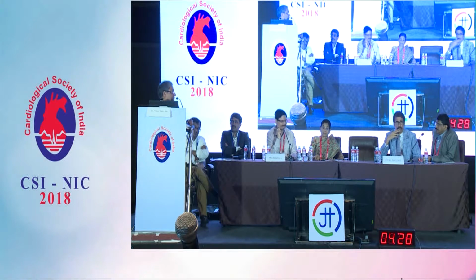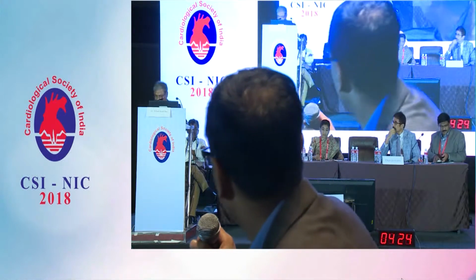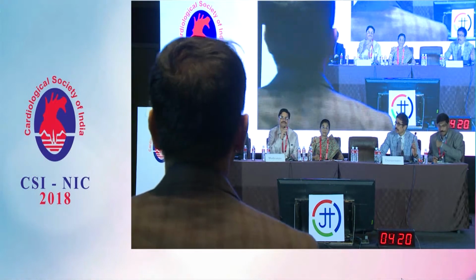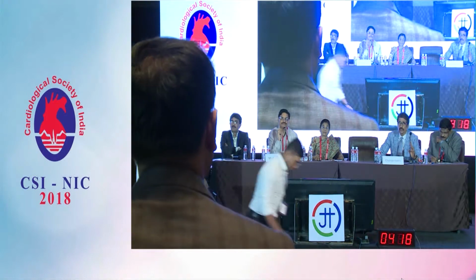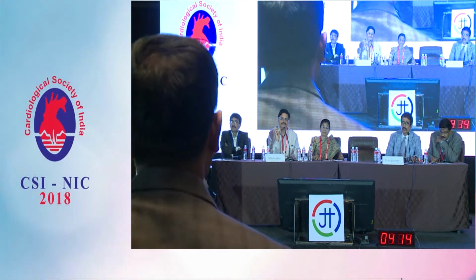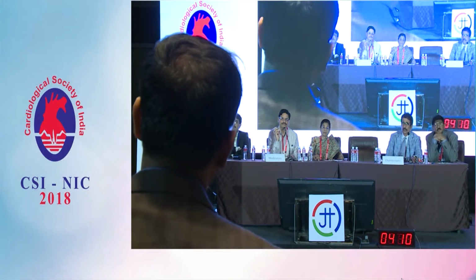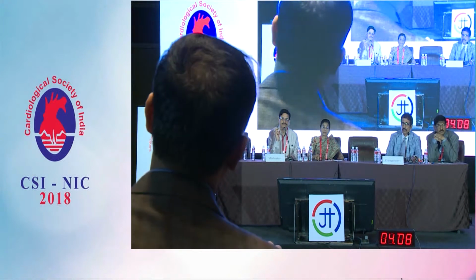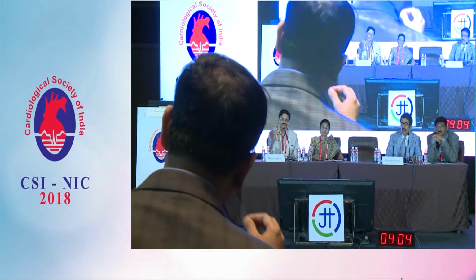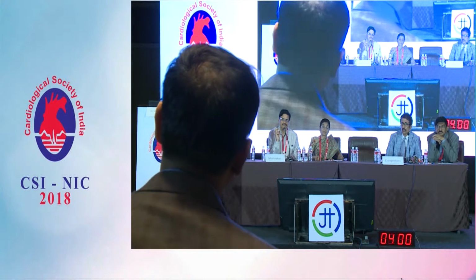Very good. Sir, one small tip. It's an excellent case, and very nice. Sometimes if the microcatheter is not available, one can take a small 2 millimeter balloon, rupture it outside, and take the balloon up to the place where you want and inject contrast through the place where you inflate. That will also do the same thing. You can deliver drugs also through it, and you don't need to lose the wire position.